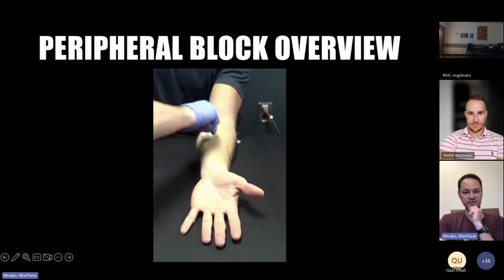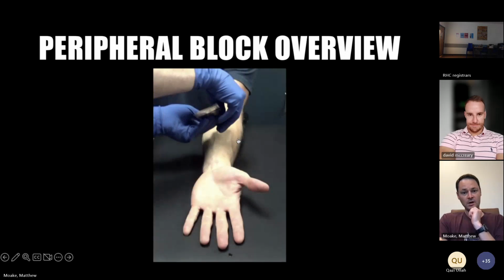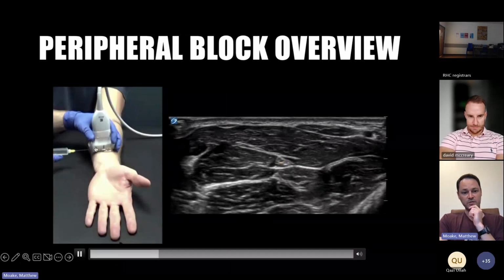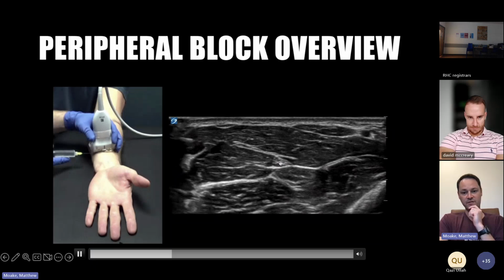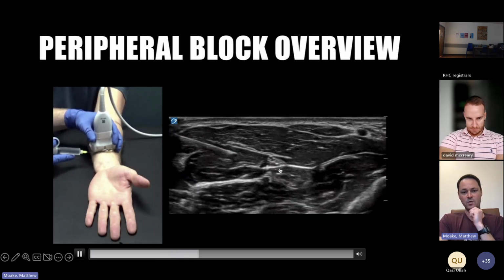Here's sort of a full span of this, someone coming in, cleaning, putting in our sterile gel, coming in. In this case, we've got just a Tegaderm over the probe, coming in, got our nerve here, muscle planes, needle coming in plane from this side, walking into it.